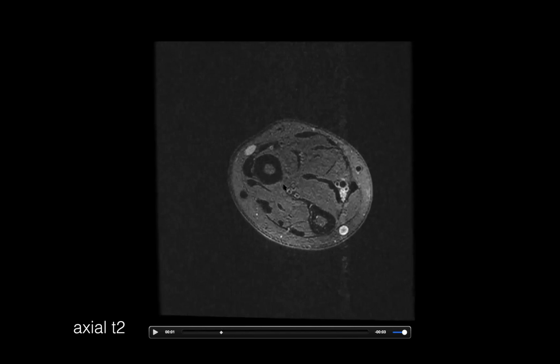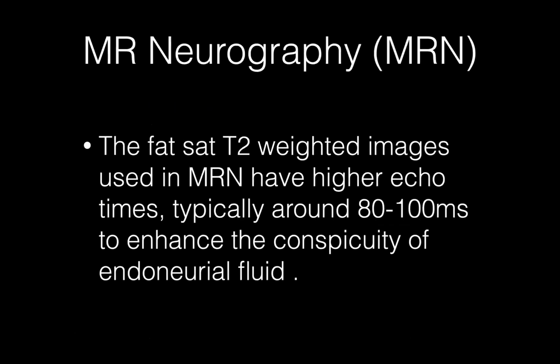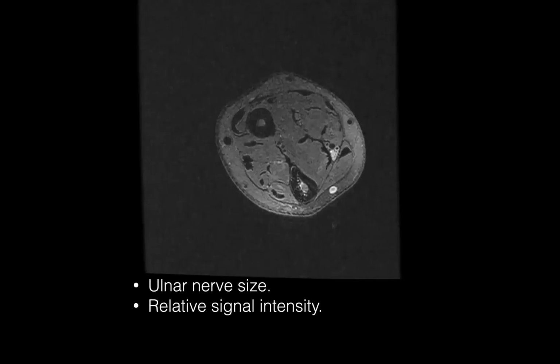There are other pulse sequences where you motion sensitize it even more. For example, there's a DESS sequence that can do that, where there's a little bit of diffusion sensitivity. And then the arteries and the veins have no signal, and all that's left is the nerve. But that's not the case here. Here it's just from pure anatomy.